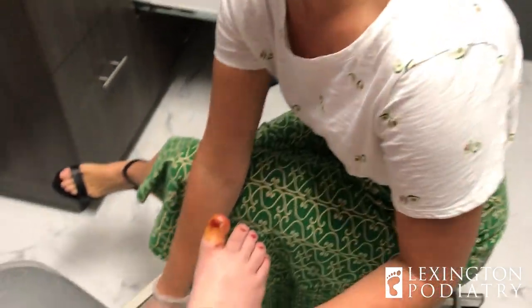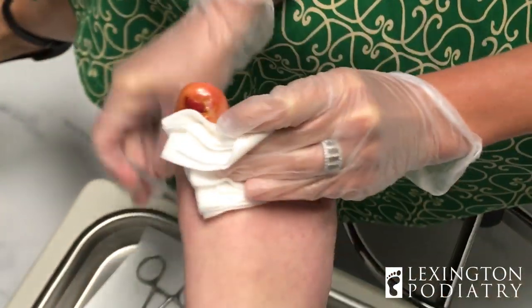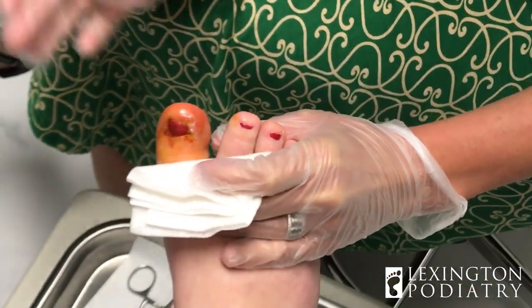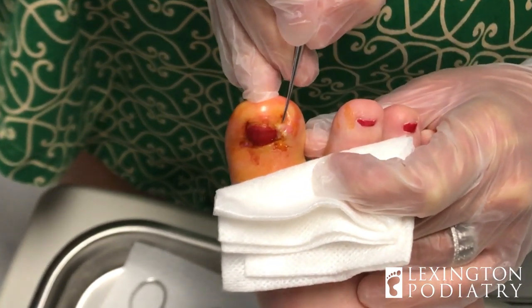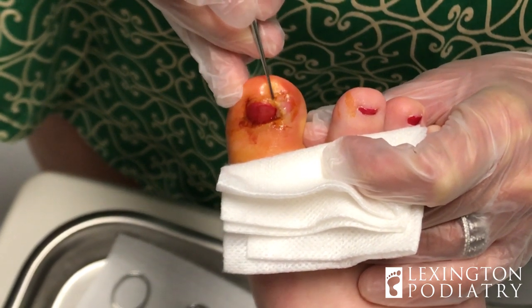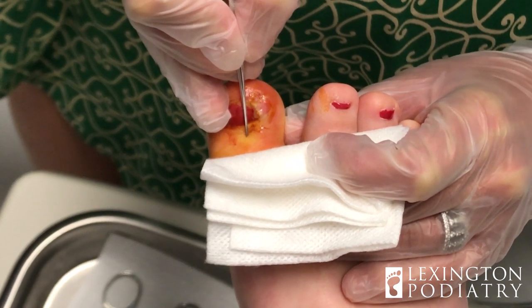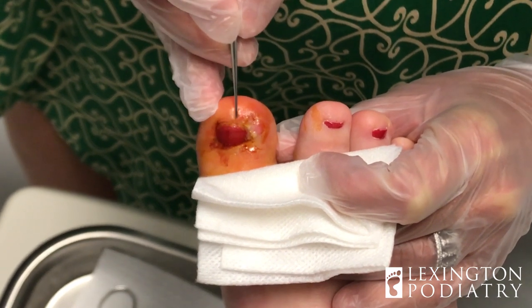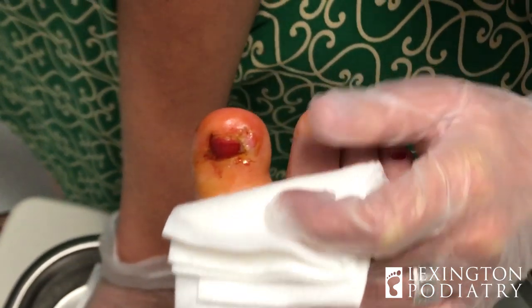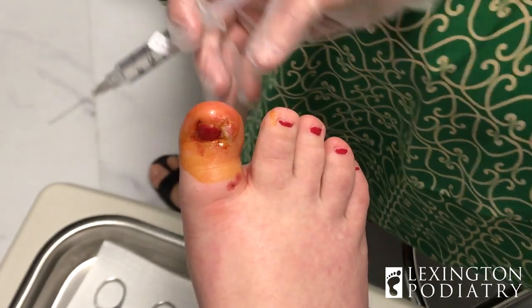Okay everybody, we are back. We are hopefully nice and numb — I'm definitely going to check it before we get started. She had a horrible experience the first time around, but we're hoping her second time isn't going to be anything like that. I'm going to keep it covered from you. Tell me if you feel any sharpness. I can feel it but it doesn't hurt — just kind of a pressure feeling. Okay, let's stop and we're going to put a little more in. And that was the bottom one — you may not feel much of this at all.